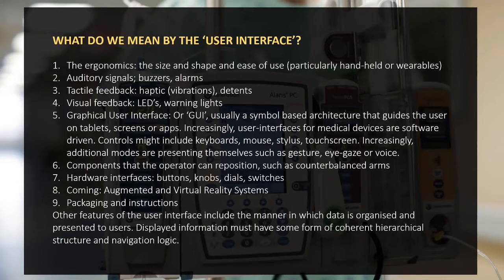Just while you're on that, I'll share an example which Genesis is doing. It's a virtual reality rehabilitation system for people who've had a brain stroke and have lost the use of their hand, the coordination, just things like picking up a cup or a toothbrush, and the wiring is all still there. There's nothing physically broken. It's just that the neural pathways are not there. So you need to regenerate the neural pathways.